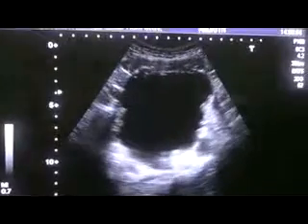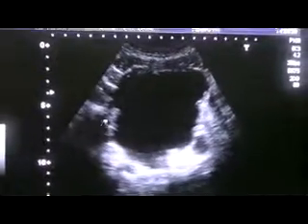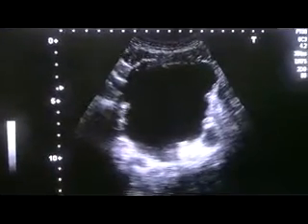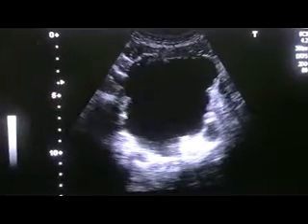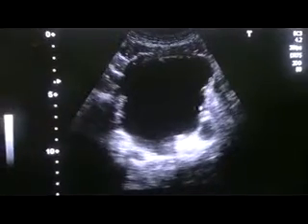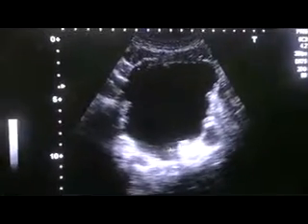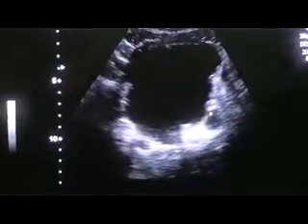Now this is the urinary bladder of this gentleman, and you can see this is the wall where I am moving the cursor. These tiny linear protrusions, some more echogenic, some less echogenic, are hypertrophic trabeculae, and here you also see the right lateral wall and the left lateral wall, so hypertrophic trabeculae are seen. Now there is a small amount of dependent debris seen, blood or pus, and what is this eye-shaped structure?